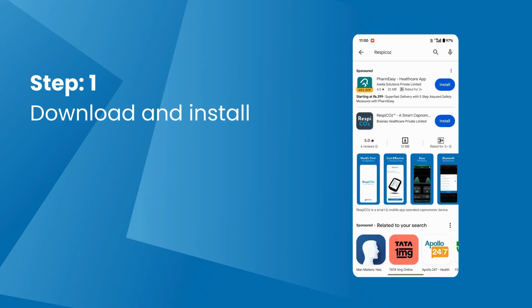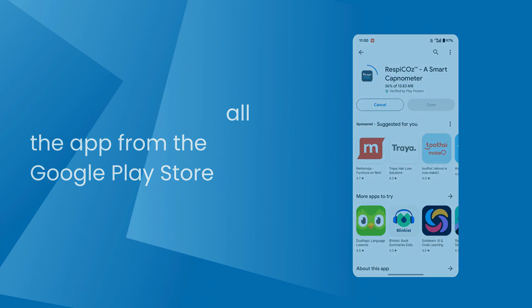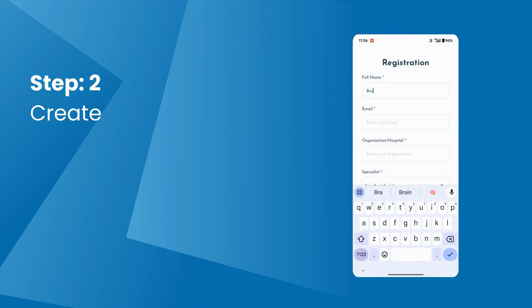Step 1: Download the Respecos app from the Google Play Store. Step 2: Now create an account in the Respecos app.